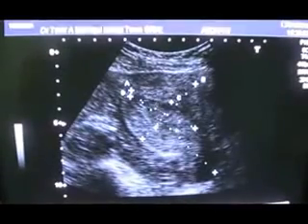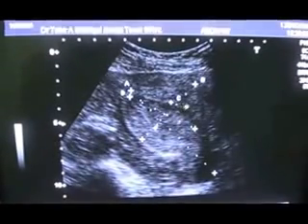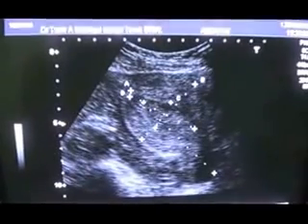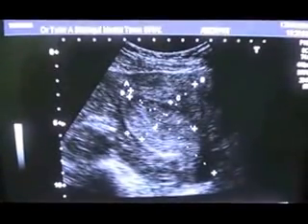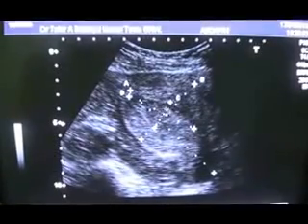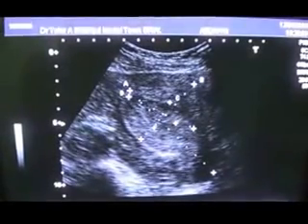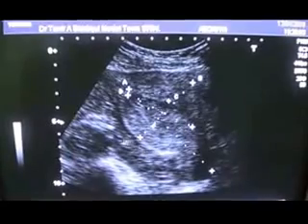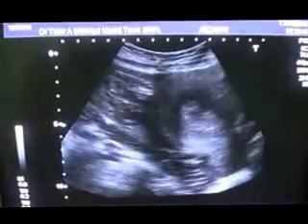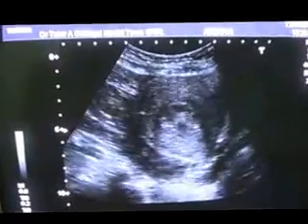So it is a dilated endometrial canal, and it is filled with different strength internal echoes. And what else is seen, in this particular view of the longitudinal section of the uterus, is that this is all fluid filled with echoes of different strength. Now this is a real-time study.